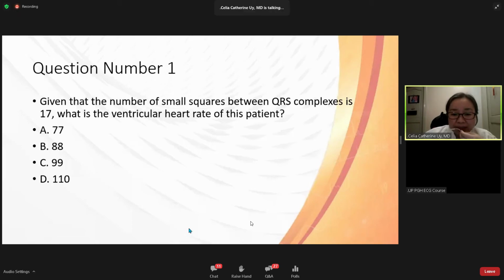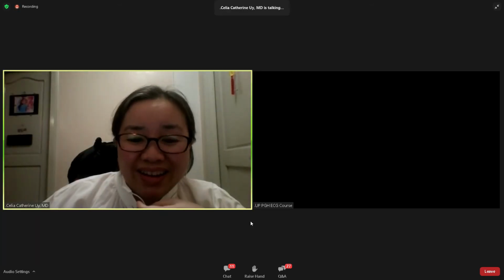So I'll try and show the ECG again. Okay, hang on.